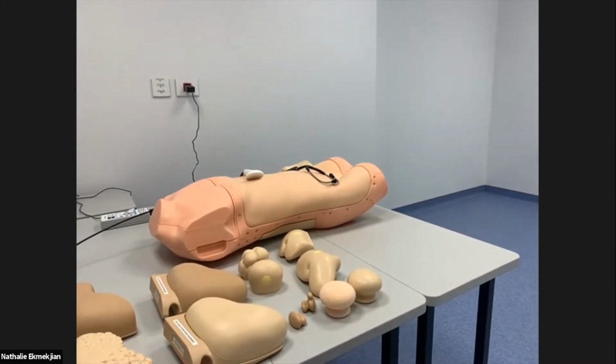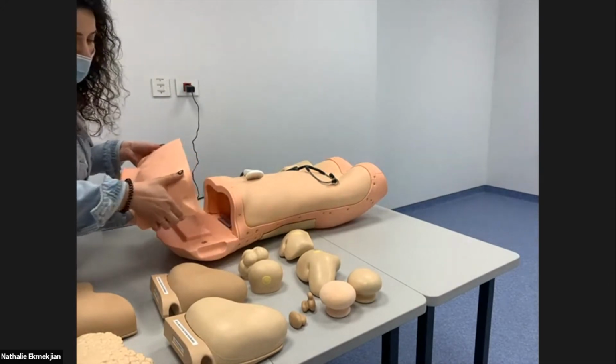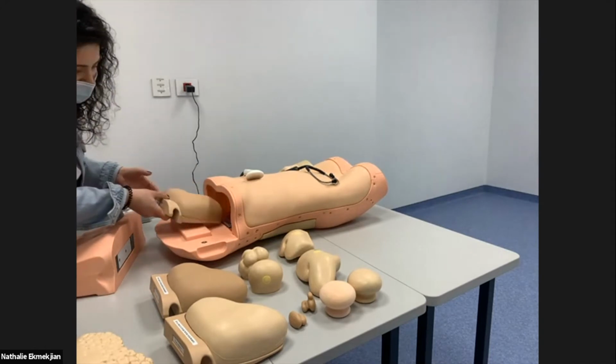Okay. To start first with the palpation, how we can put the interchangeable modules. So first of all, we can remove the upper torso, and we can place one of the livers in this way.